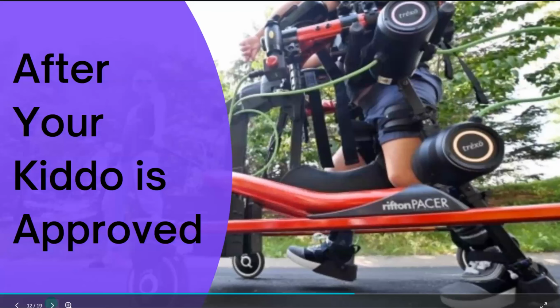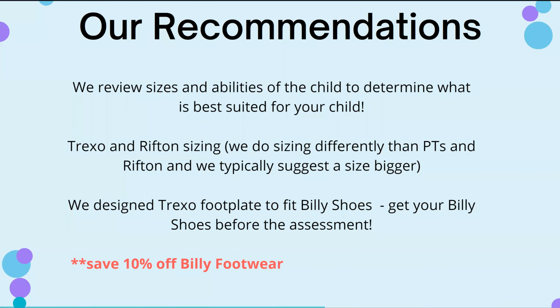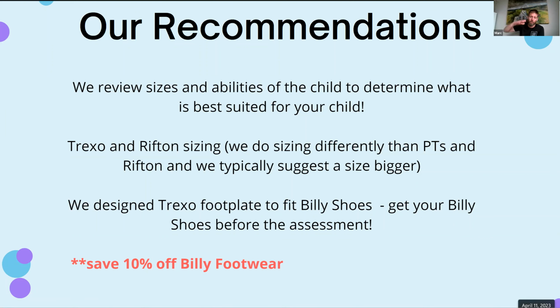I actually wanted to add one thing. Mark, just if you can clarify, are Billy shoes and Mimo shoes mandatory or can any other shoes also be used? So effectively, it all depends on the child's ability to get heel strike, because the Trexo really requires heel strike when walking. We've had some kids who don't have the tendency to push down in plantar flexion and put their toes or the balls of their foot down first, and we can just get away with kind of any type of shoe. But typically what I end up seeing a lot of the time is the other.